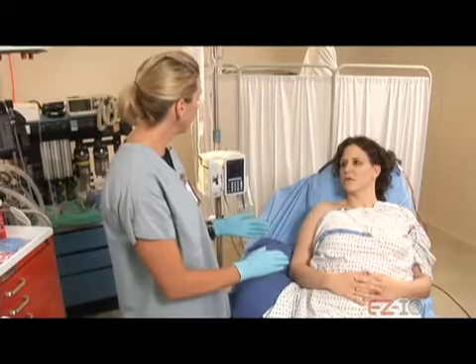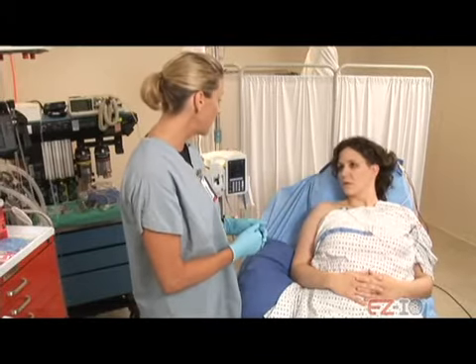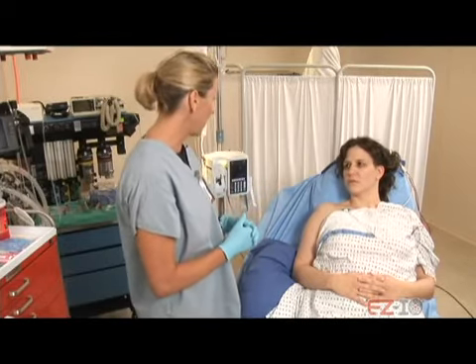Okay, so Karen, we were not able to get IV access, so what we're going to do is we're going to get vascular access by putting it into the bone. So what you're going to feel is it feels a lot like an IV when it's going in. You're going to feel a little bit of pressure when it's going into the bone, and then I'm going to give you some medication once it's in there that's going to help to numb that area up so you won't feel anything after that, okay?